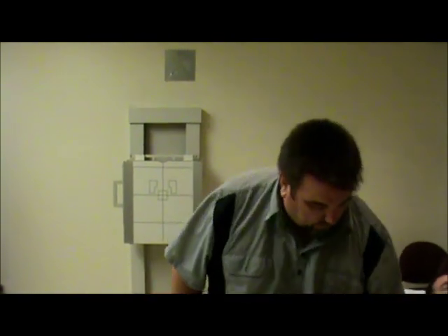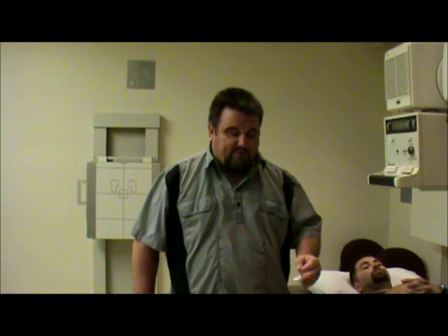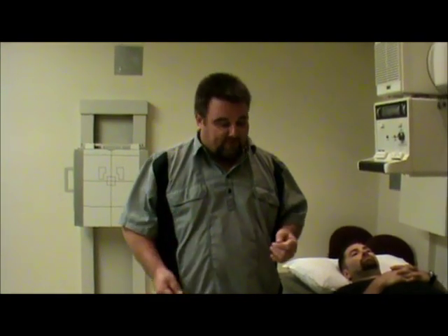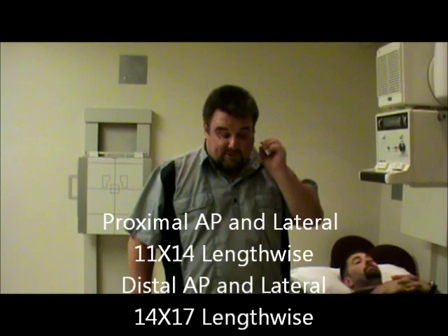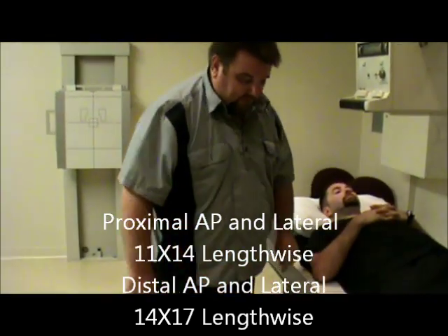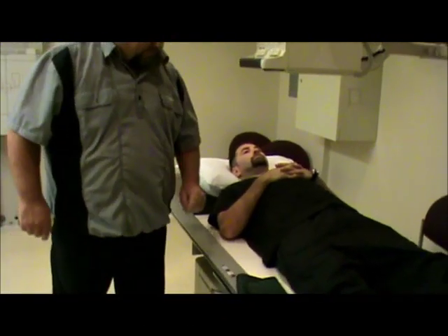So what we're going to do is we're going to start with the femur. If you'll remember back when we did the hip x-ray, we used a 10 by 12 for the hip. With the femur, and having to have overlap — you need one to two inches when you overlap films — we're going to go to an 11 by 14 so we can get more of the femur on it. The centering is actually going to be the exact same as it was for a hip, so the main thing that has changed is the film size: 11 by 14, lengthwise.